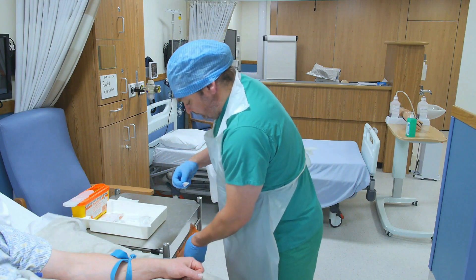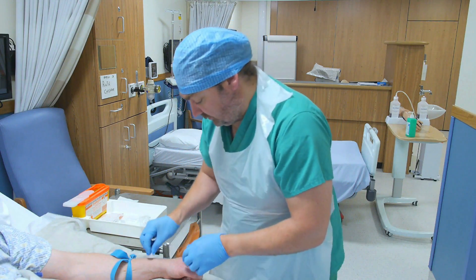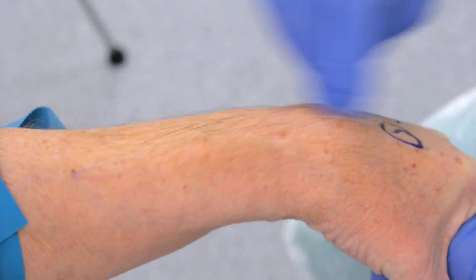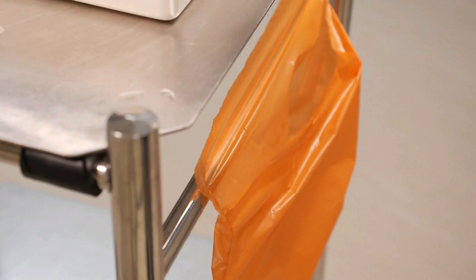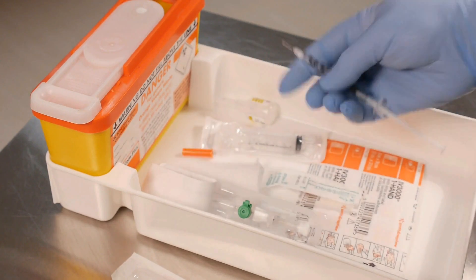Clean the patient's arm over a large enough area to accommodate the dressing. This area should be allowed to dry thoroughly. Do not repalpate the vein.